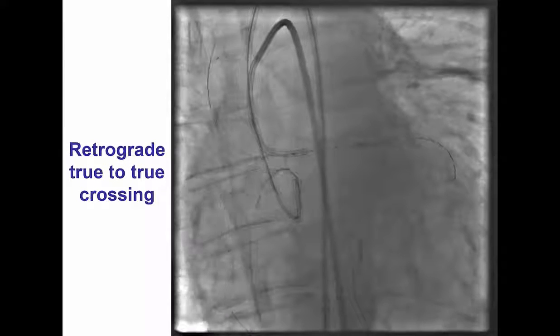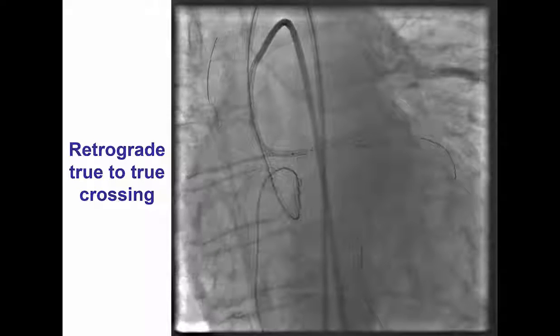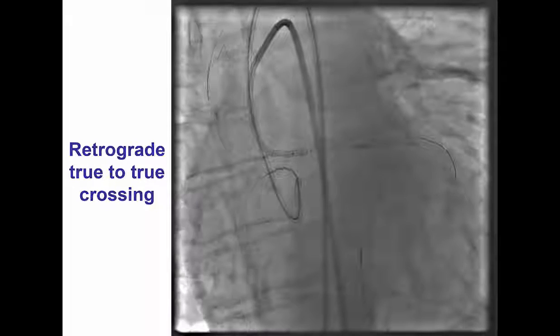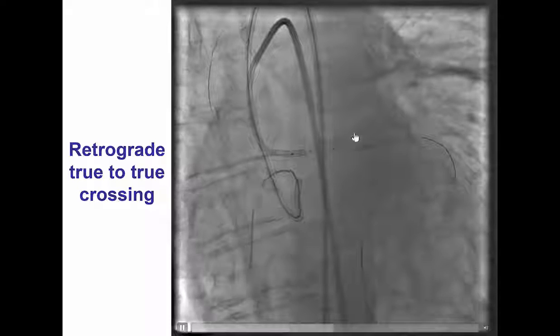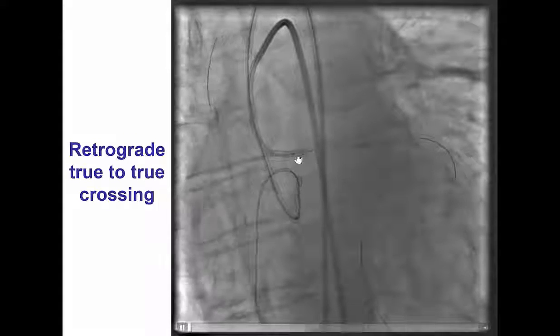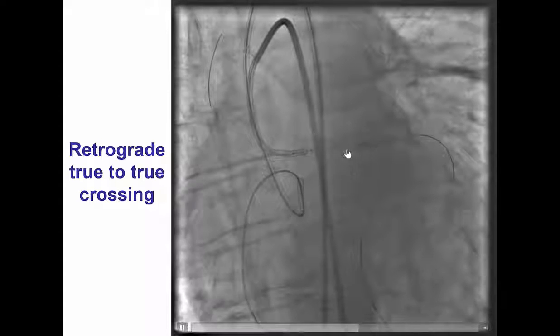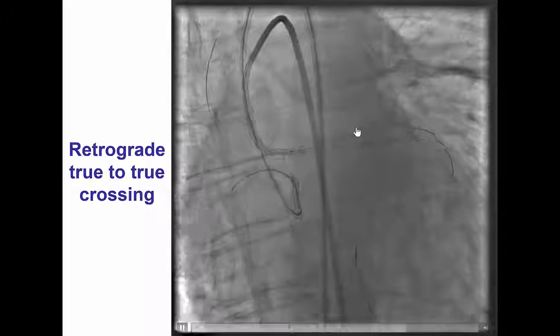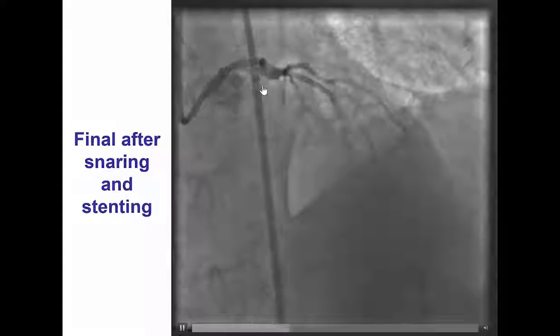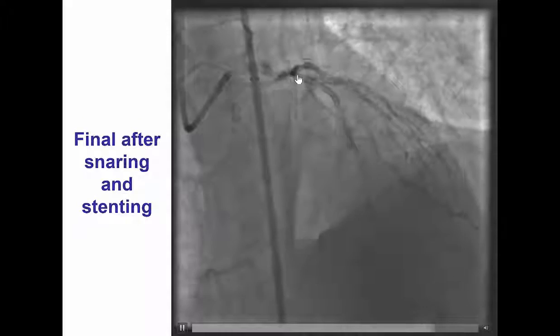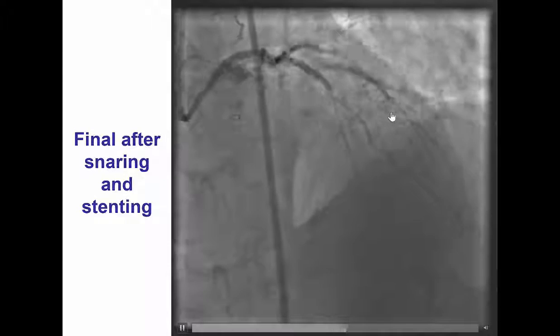In this particular case we tried to deliver the microcatheter but were unable to, and eventually we attempted retrograde crossing. To our pleasant surprise, we were able to advance the retrograde wire all the way into the proximal true lumen and into the aorta. We confirmed that re-entry had happened proximally to minimize the risk of dissecting or injuring the left main. Intravascular ultrasound confirmed the wire had entered the true lumen within the proximal LAD. We were then able to externalize the wire and deliver a stent, restoring antegrade TIMI 3 flow into the LAD and the diagonal branch while maintaining patency of the diagonal branch at the proximal cap.